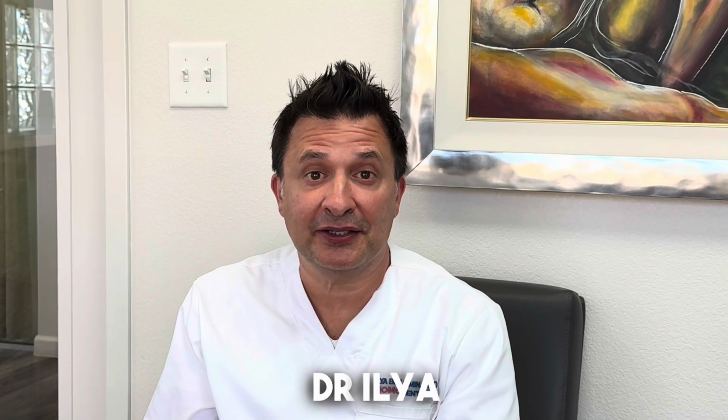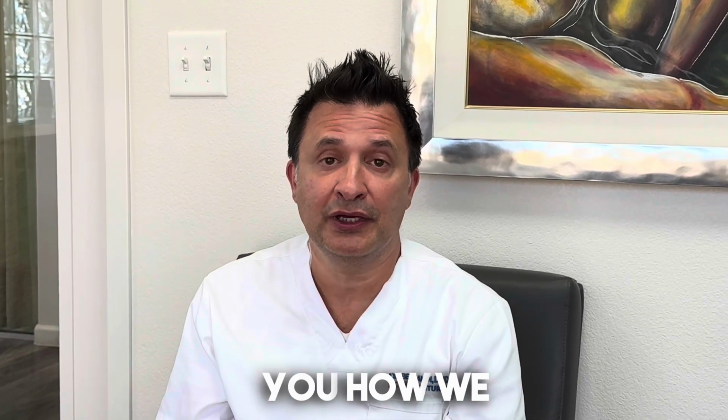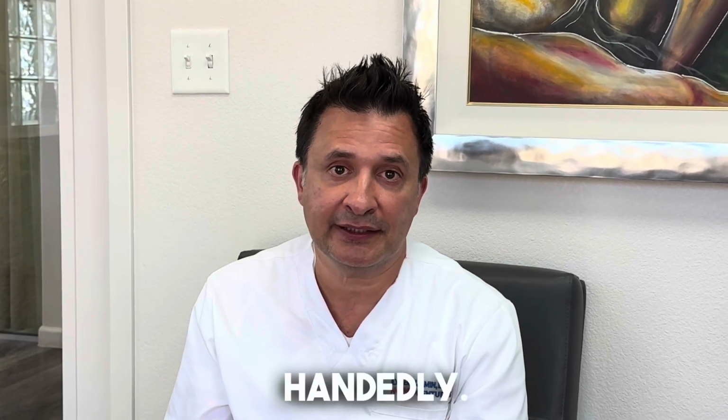Hi, my name is Dr. Ilya Benjamin and I practice in Las Vegas, and today I'm going to share with you how we place a dental implant using virtual software called ExoPlan. You see, sometimes when a dentist needs to place an implant in a tight space, we can't really do it free-handedly. We need to utilize a software.